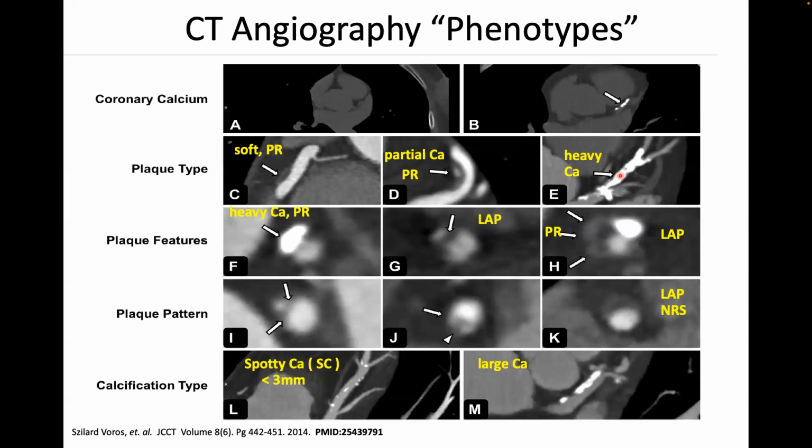So ideally you would delete this calcium signal and see how much blood remains. When you take the patient to the X-ray angiography lab and they inject contrast in this vessel, X-ray angiography is not that sensitive to calcium, not as much as CTA. And so they will see a pathway through this lesion in the angio suite.